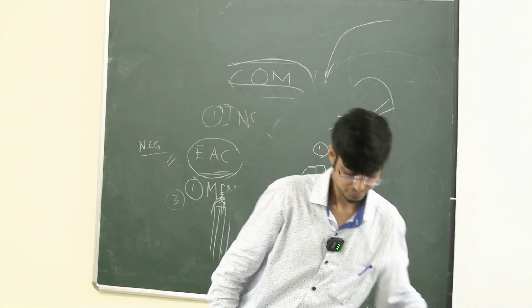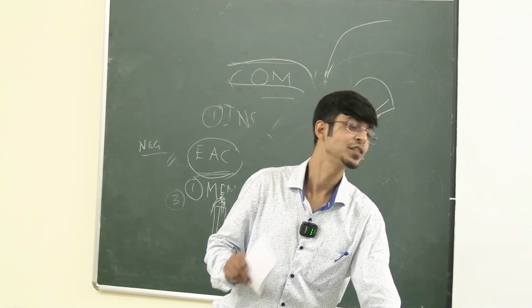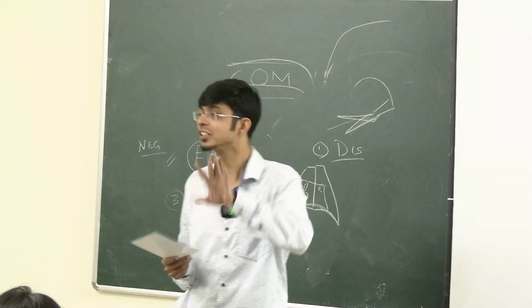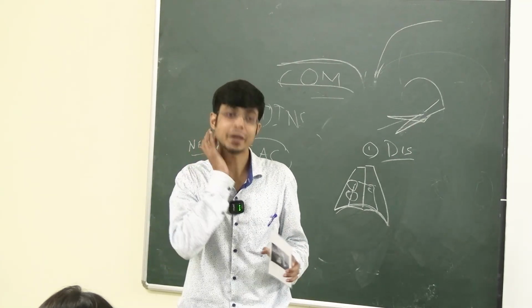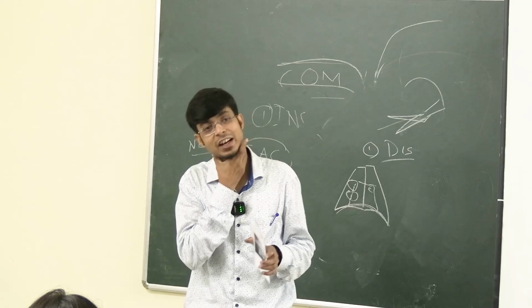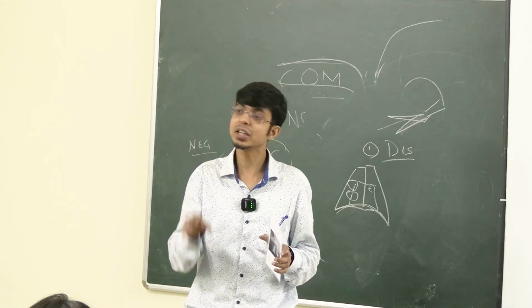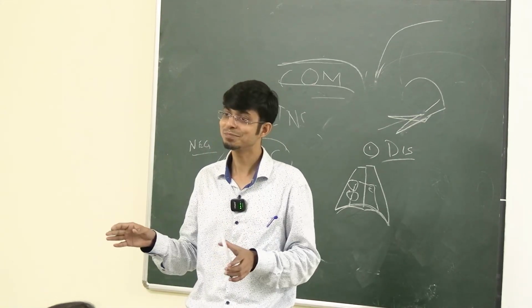বললাম তো রিভার্স Townes view to see the styloid processes. Mainly styloid process দেখার জন্য, because there is a syndrome called Eagle syndrome or stylalgia. The patient will come to you with chronic pain, mostly on one side of the throat, or may have bilateral pain, mostly when swallowing, having difficulty, that is dysphagia, in swallowing food, and it's a chronic problem for quite some time.